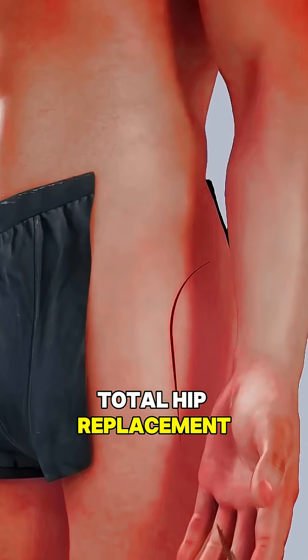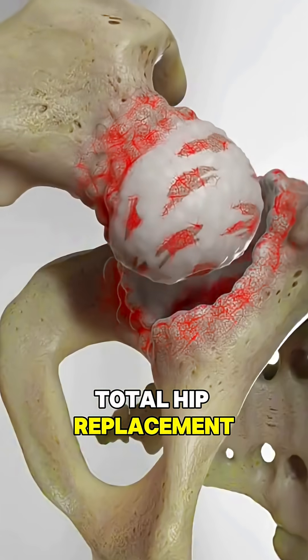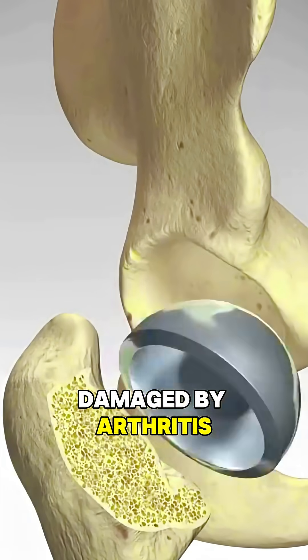Ever wondered how total hip replacement surgery restores movement and relieves pain? Total hip replacement surgery is performed to relieve pain and restore movement in a hip damaged by arthritis or injury.